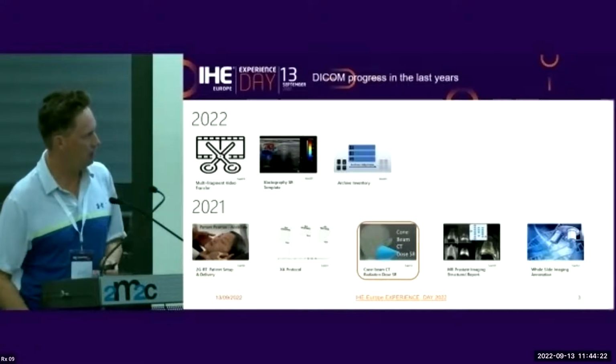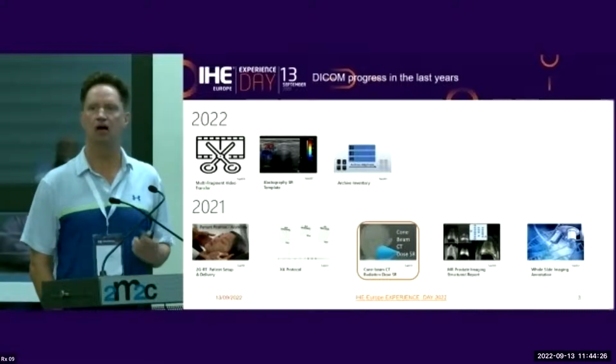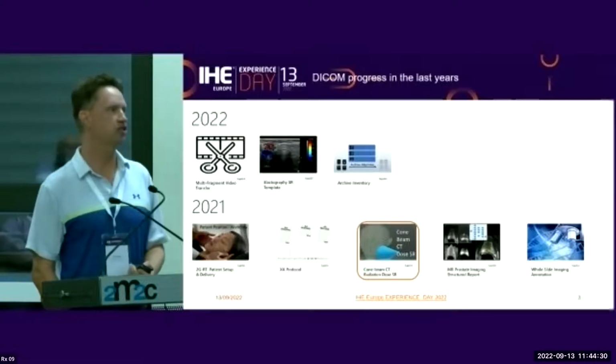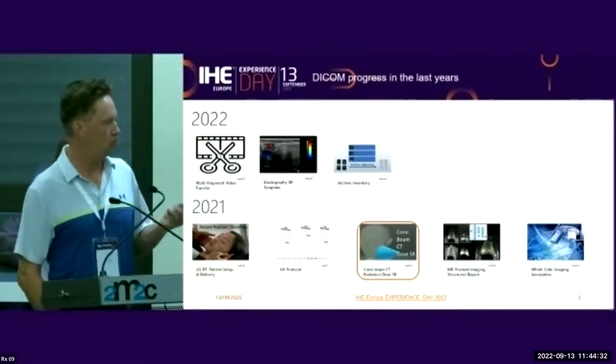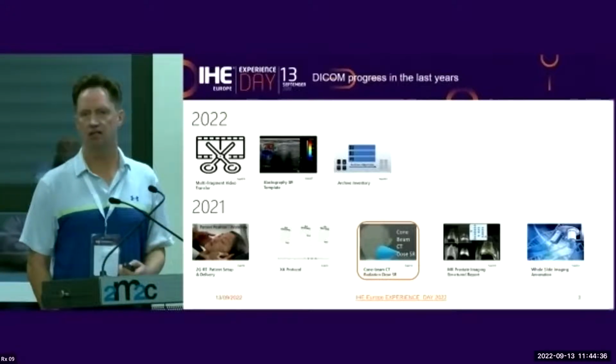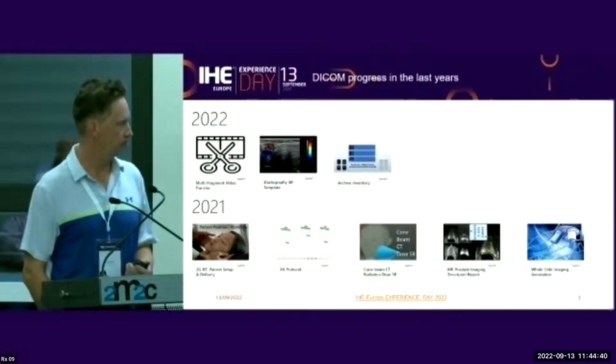And then we have a lot being done in the direction of structured report and how to record dose, radiation dose information. So one example is this cone beam CT, but there are many, many other extensions where dose is the important topic.